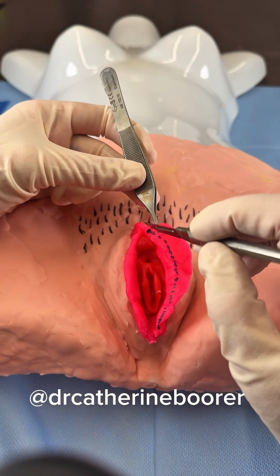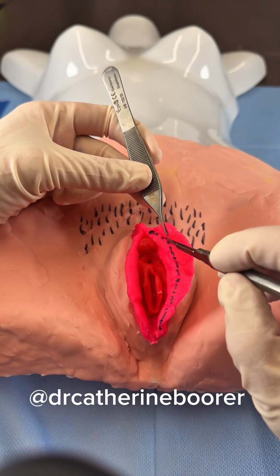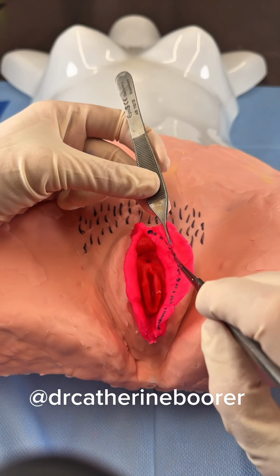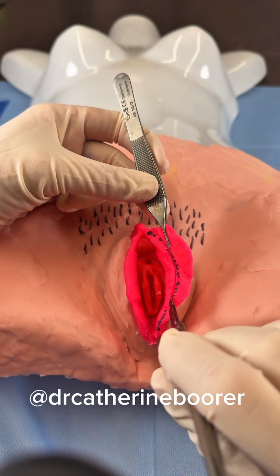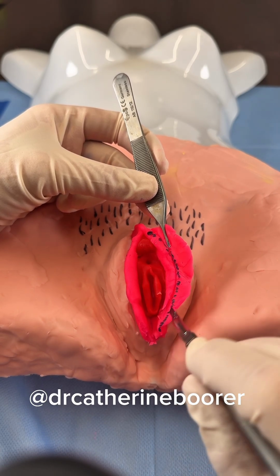And this is the opening to the vagina. I'll just repeat that process on the other side. And you see when I'm doing this procedure, I haven't actually just made a straight line cut. I'm not just picking up and pulling off the labia. What I'm doing is trying to replicate the normal shape or the curved shape of a labia minora so that after the operation, it looks like a normal labia and no one will tell that she's had the surgery.